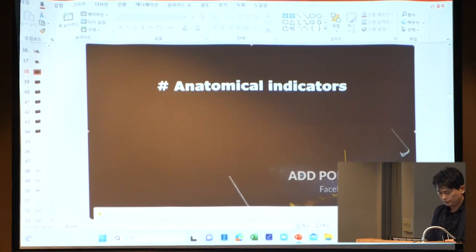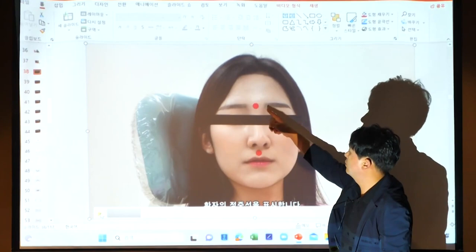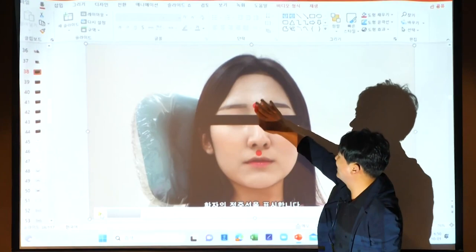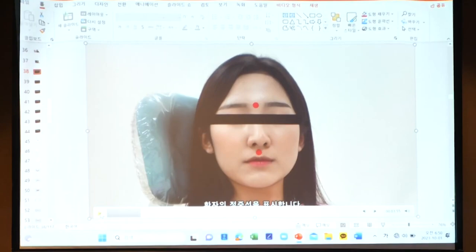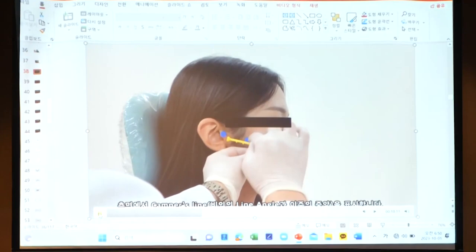This is the anatomical indicators. First of all, you have to mark the midline of the face, like this. And then position this one, and then this one. This indicates the midline of the face. This is the alar. This is the camper's line.